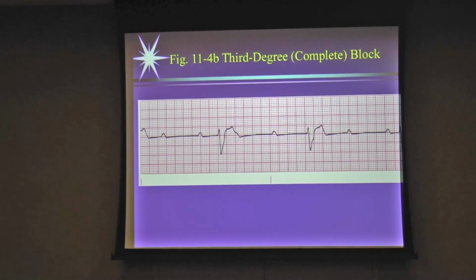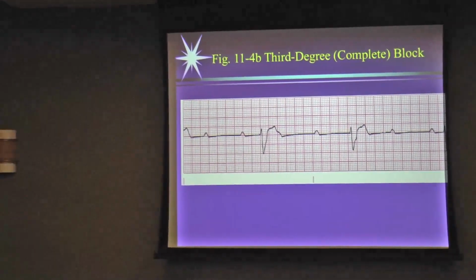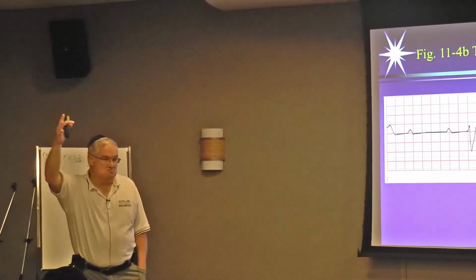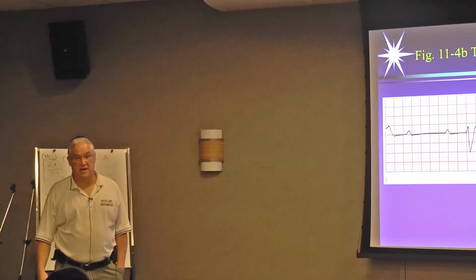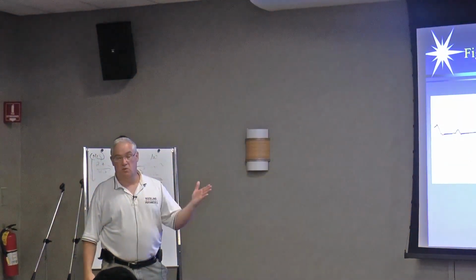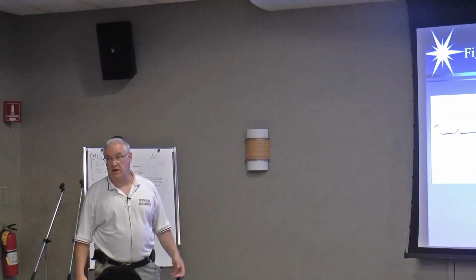The worst thing that could happen in a patient with third-degree heart block is that the ventricles just don't fire anymore. So what you would basically see is just P waves going across the screen. They call it ventricular standstill. The ventricles no longer decide to be the backup pacemaker, and within 2 minutes, 3 minutes, they're going to be asystolic. I mean, they're dead immediately because there's no ventricular contraction, but in a couple of minutes, there'll be no more atrial contraction because the pacemaker will be deprived of oxygen and it will no longer fire.